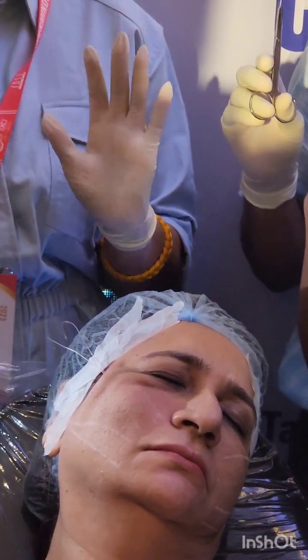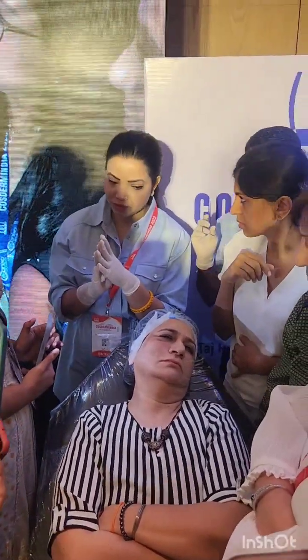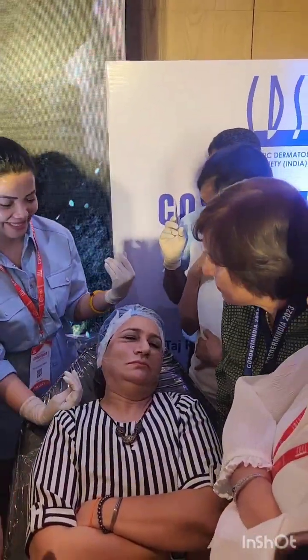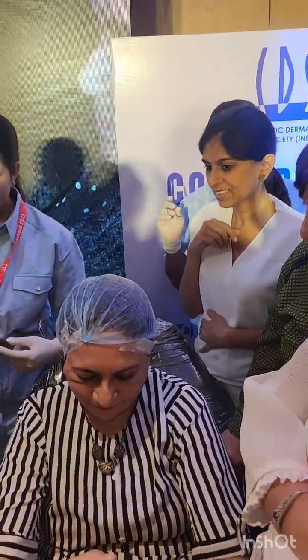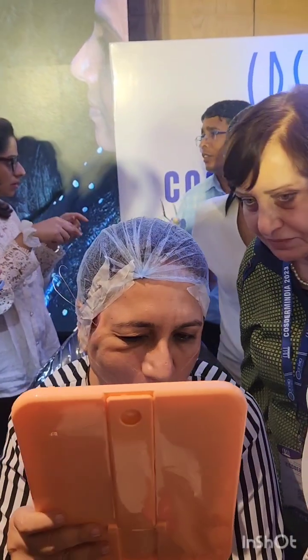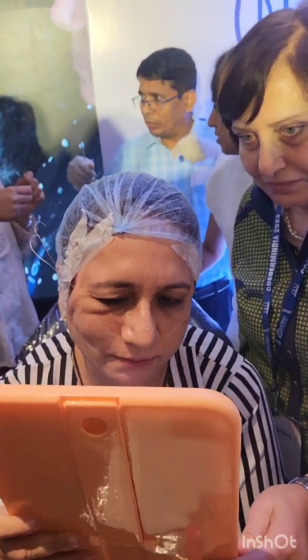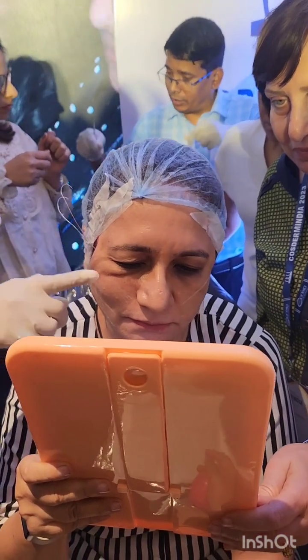Now I will always let the patient sit back because otherwise they will never differentiate how much lift and benefit they have achieved out of this treatment. So ma'am, you have to sit back again, sorry. Can you see the lift you have got? Don't get scared because the thread is still. Don't worry. Can you see your line? There is a dimpling. If you want, you can release it. But I would say never release it.